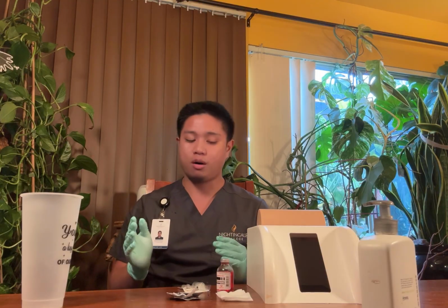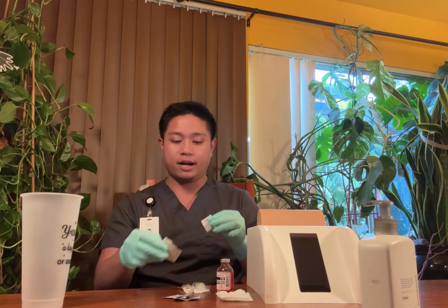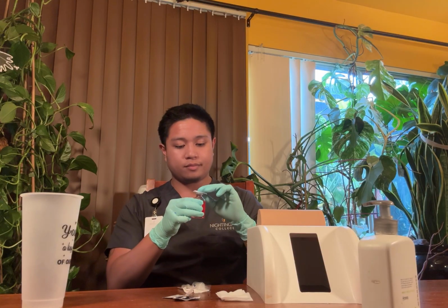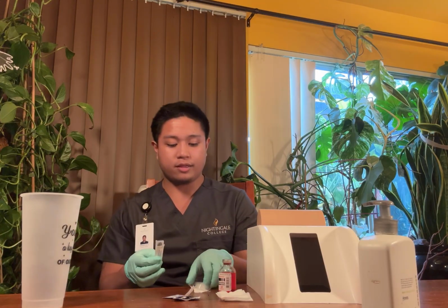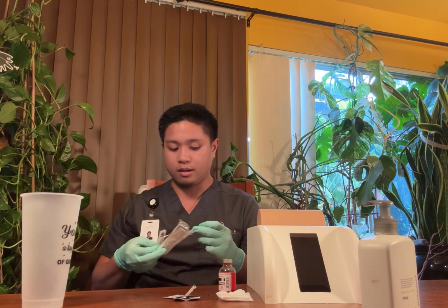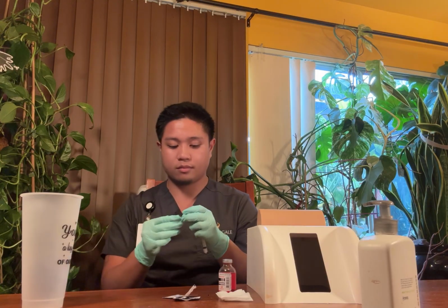Okay, so I'm now going to get my alcohol pad and clean the top of the vial and let it air dry. I'm going to throw that in the trash receptacle. While that is drying, I'm going to grab my syringe and the needle, and then put that together.